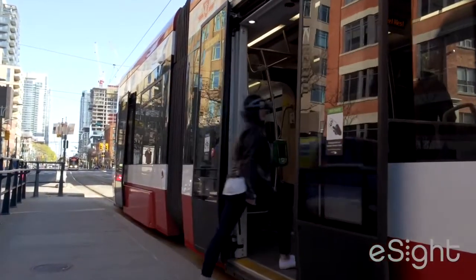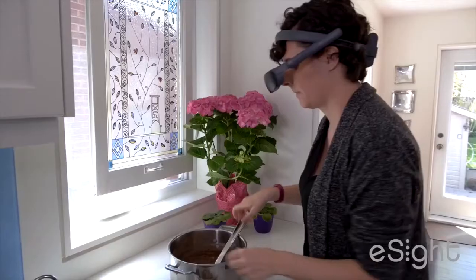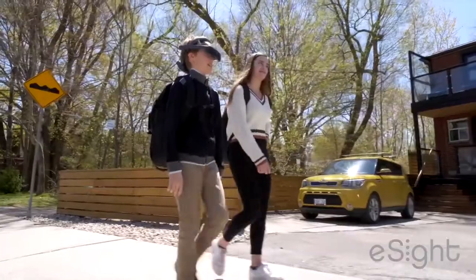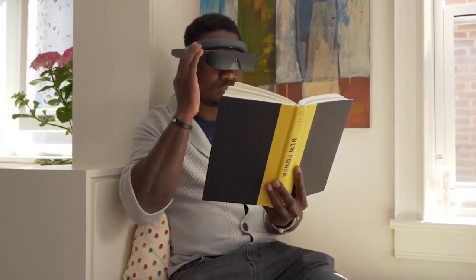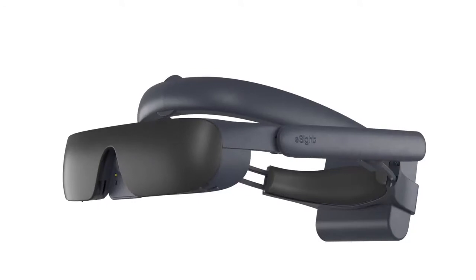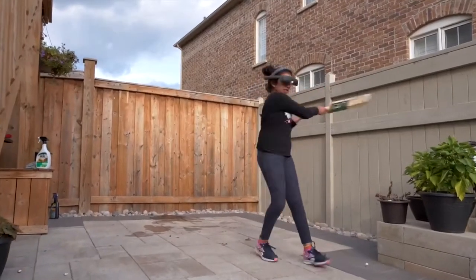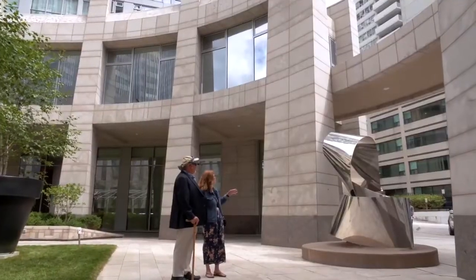eSight 4 is designed to move seamlessly with the wearer throughout their day, from sitting reading to activities indoors and out. It is fully wireless and features built-in vision controls. The visor incorporates the wearer's natural peripheral vision. And for maximum mobility, our patented bioptic tilt allows the user to access even more. Tilt the visor partially up or fully out of the way, ideal when connecting face-to-face or exploring new places.